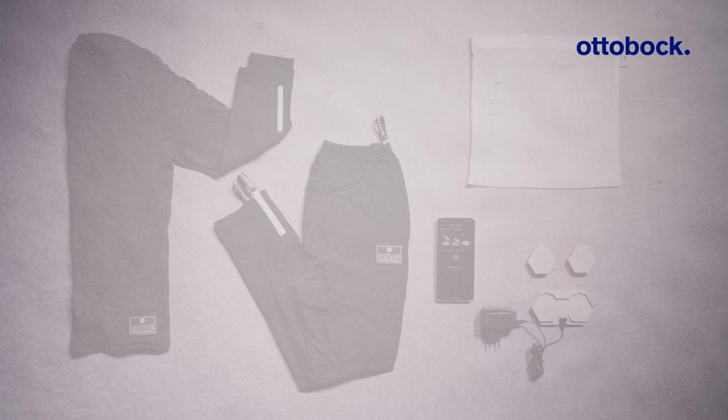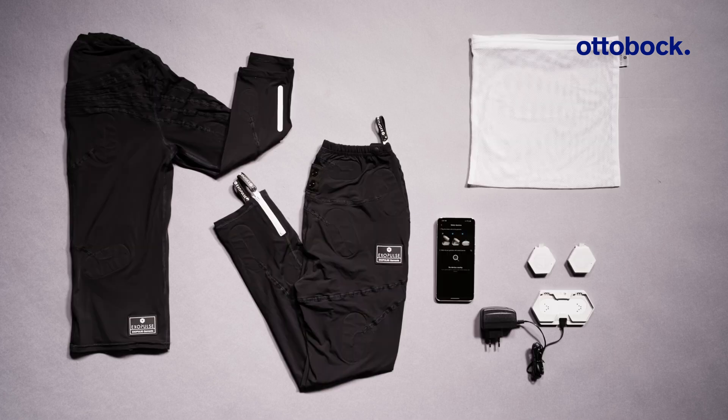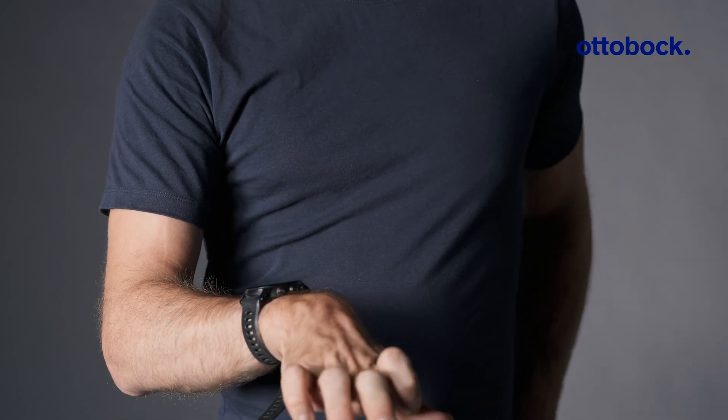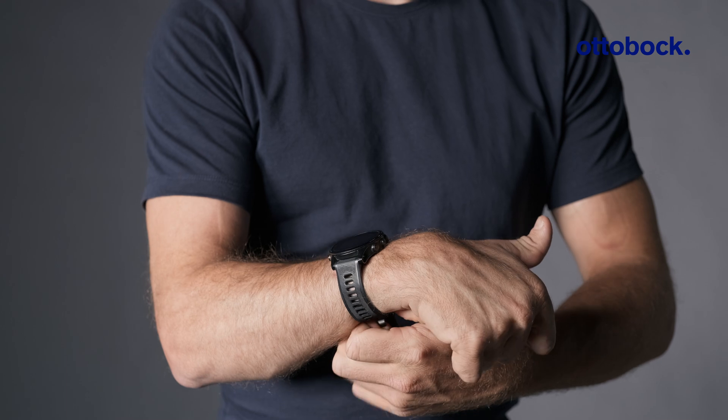Before beginning the stimulation, ensure you have all necessary components and a smartphone with internet access readily available. Do not wear any jewelry or accessories that might come into contact with the ExoPulse suit, and ensure the skin is clean, intact, and not overly dry.